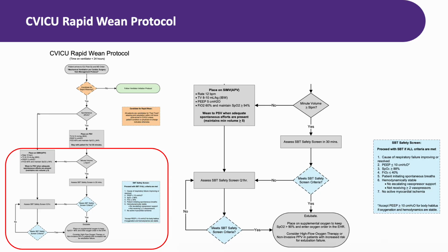Let me say that again because it's important. If the patient is on the cardiac surgery rapid wean protocol and they meet all criteria, you have the authority to proceed with extubation without waiting for a separate order from the provider. This is designed to limit delays. I still recommend communicating with your providers via secure chat.